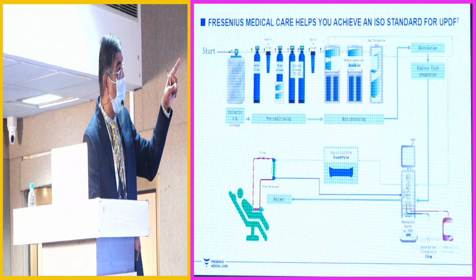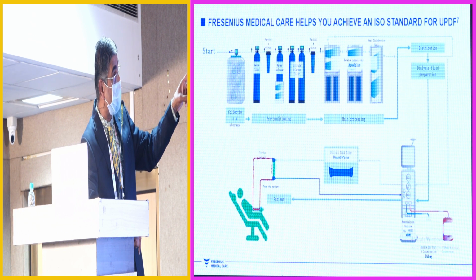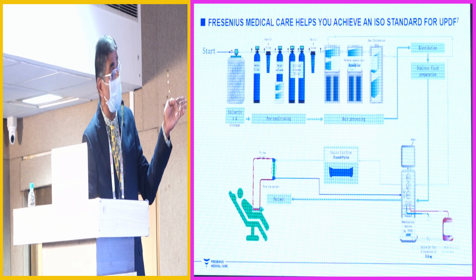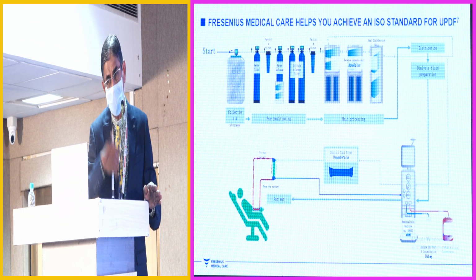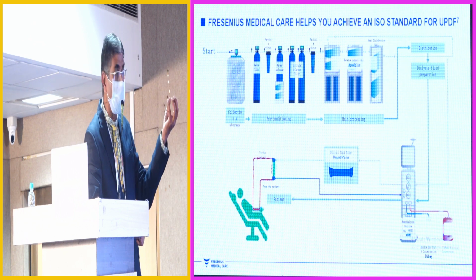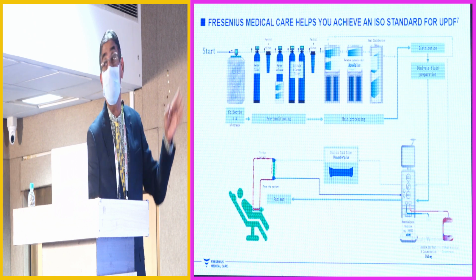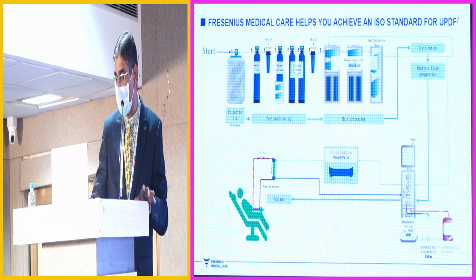Where do you need to check the calcium levels? The hardness should be checked exactly after the softener. That means after the softener and carbon filter, you should check the chlorine and chloramines. Indian RO systems are not designed properly to have a sample port after the softener and after the carbon filter. Maybe take a minute to ponder and rectify that.